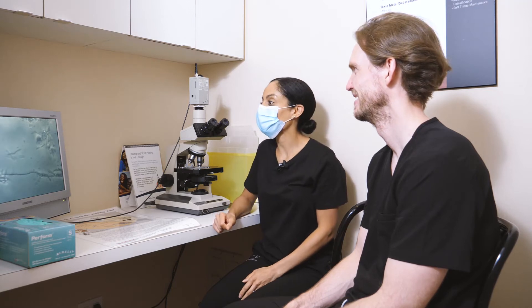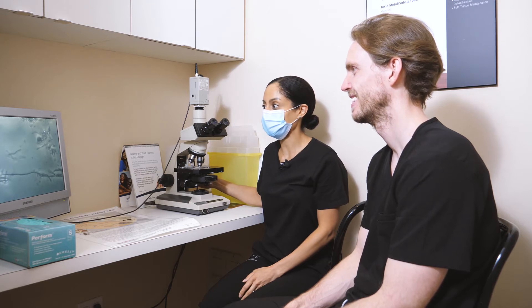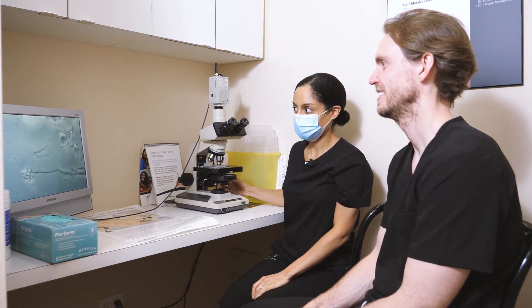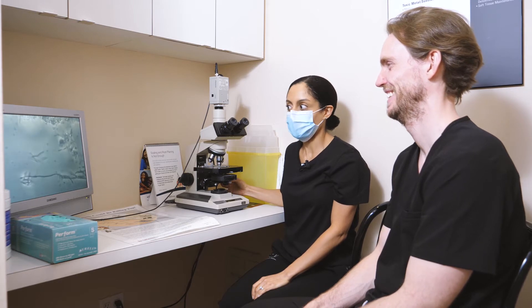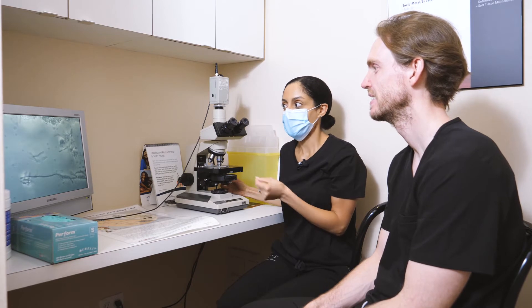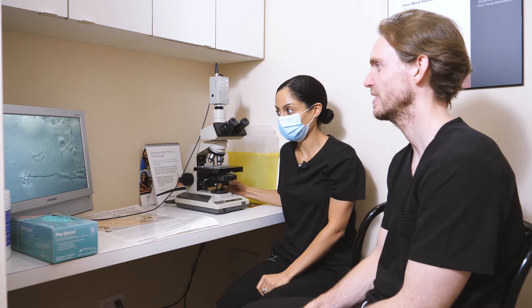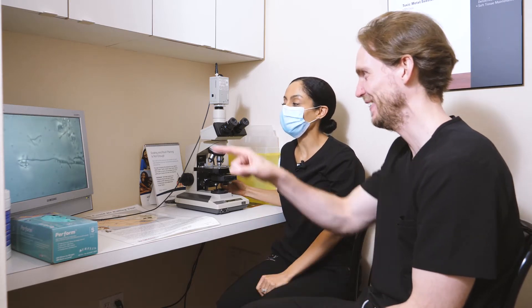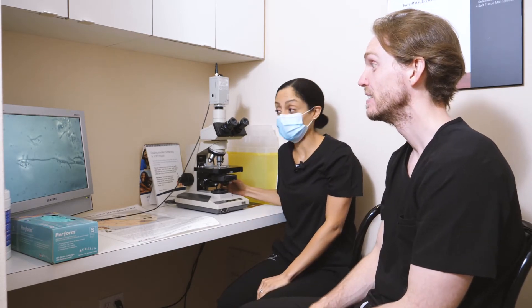All right, Dr. Graff. We've got your slide sample on the microscope here and we're going to take a look at what we see. Do you see all these kind of long lines that are on the screen? Those are called rods. Everybody has a few rods in their mouth — they are just long strands of bacteria. The size that they are depends on how long they've been alive in your mouth. That one is literally across the screen, so we know that those bacteria have been there for a really long period of time.